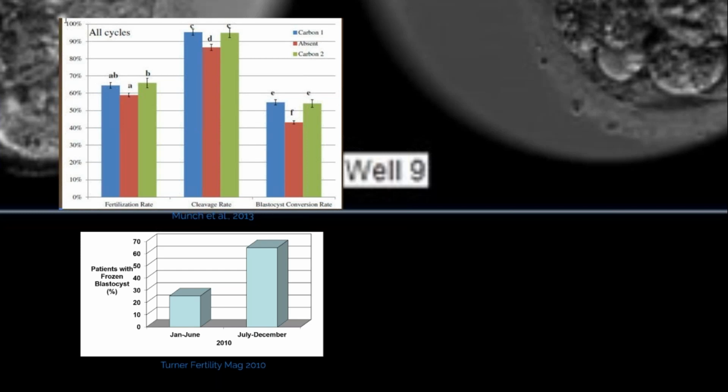It wasn't something that could be done earlier, but it was finally solved, such that starting in July, they were able to change to a new lot of mineral oil and saw a dramatic improvement. Again, a good example of a change in a product that we use. And as much as the manufacturers of these products go to extensive lengths to make sure they're safe for us, the example of mineral oil is one where we can't always rely on the testing of the manufacturer, because mineral oil is not a static compound. Mineral oil can break down and become toxic with improper storage or handling.